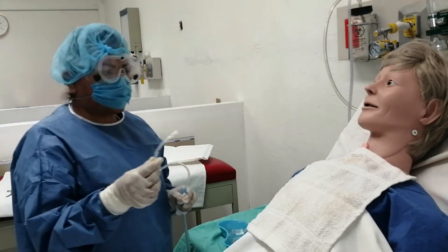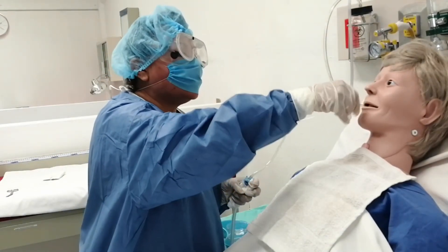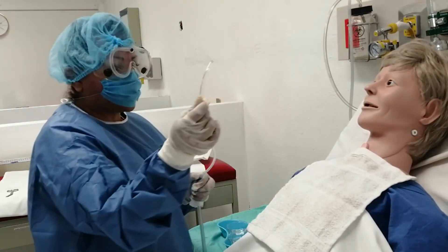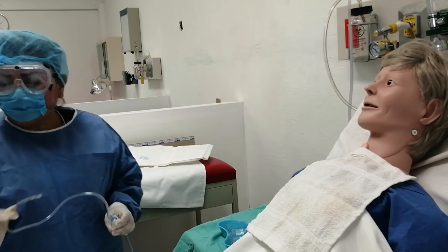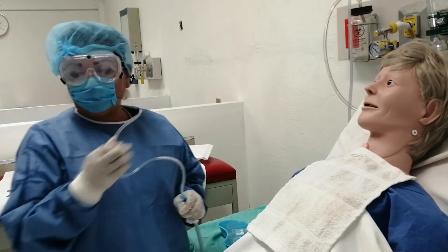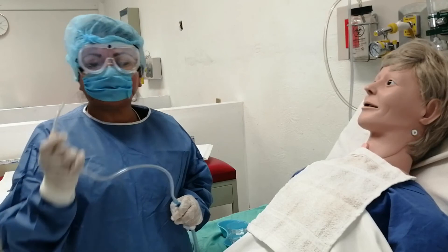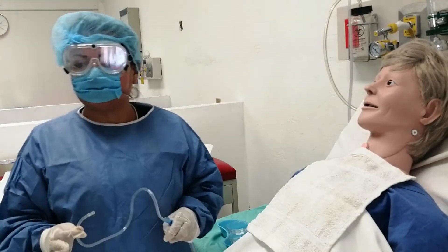Con la trampa abierta, introducimos en la cavidad oral 8 centímetros; ya que entraron, cerramos la trampa y aspiramos con movimientos rotatorios. Tiempo no mayor a 10 segundos. Limpiamos y enjuagamos la sonda en el recipiente adecuado — recordemos que tenemos dos, no hay que confundirse. Permeabilizamos y enjuagamos. Volvemos a introducir la sonda de 8 a 10 centímetros, cerramos la trampa y extraemos con movimientos rotatorios para que la mucosa no se lesione, ya que la presión negativa se pega a la mucosa.